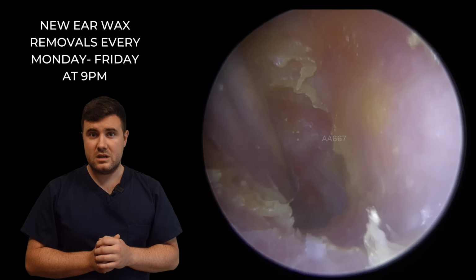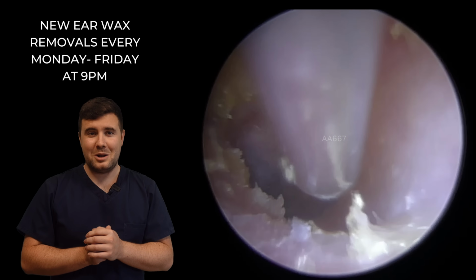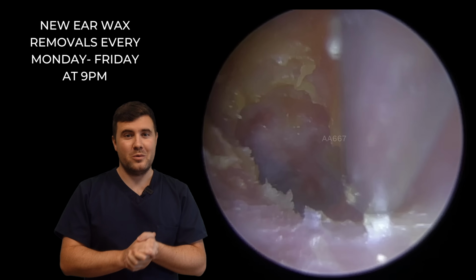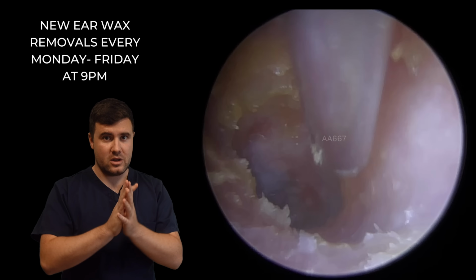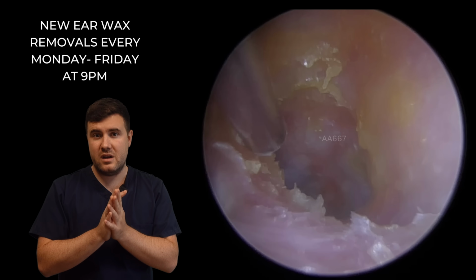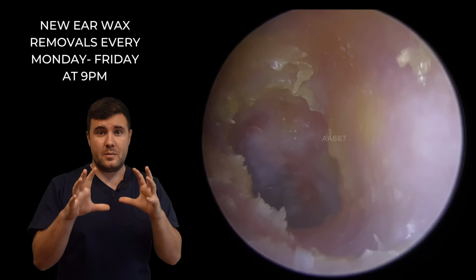There we go. We've got a nice. Oh, it's just broken away. I was just going to say we've got a nice little grip on that last section, but it just tore away. We're going to leave the rest of this in here. This is, like I said, a very sensitive area, difficult to remove comfortably. It's not going anywhere, so we're happy to leave that as it is.